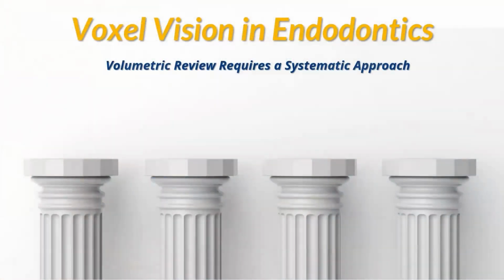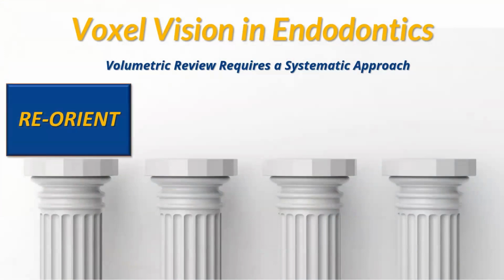The basic background of looking at teeth and pathology related to endodontics is that we must have a systematic approach. And this approach is the same no matter what type of pathology we're looking at. And there are four pillars to that approach. The first is reorientation of the data set. This is of primary importance, or we're going to introduce some interpretive errors.